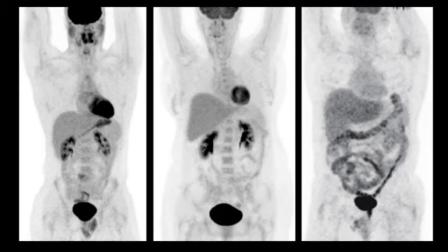These are 3 examples of a normal distribution of FDG within the body. Again, these are MIP images, a 3D representation of the PET data. You can see that the brain is an obligate glucose user, so usually is the most intense organ within the body. You can also see that unlike normal glucose, FDG is excreted in the urine, so you'll see intense activity in the renal collecting systems and in the bladder.